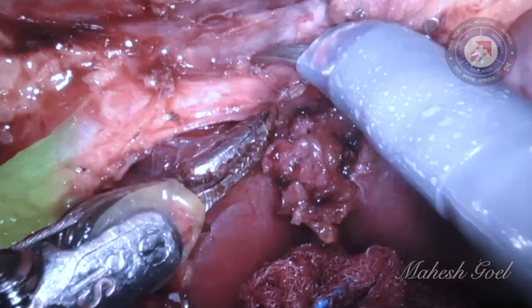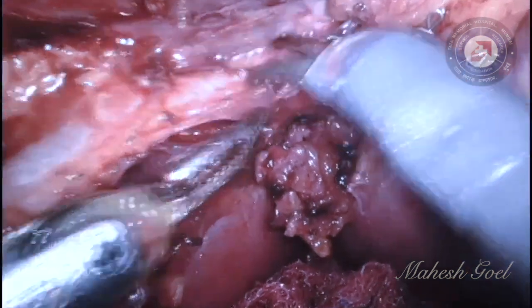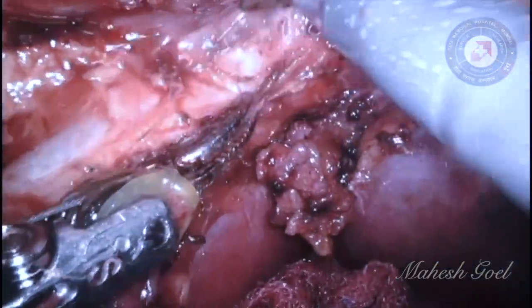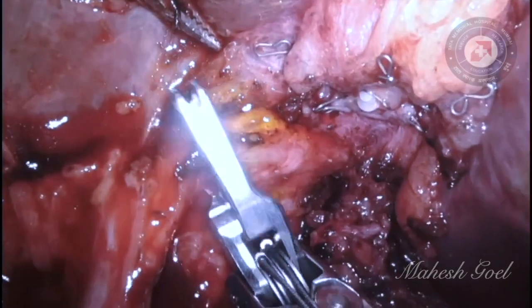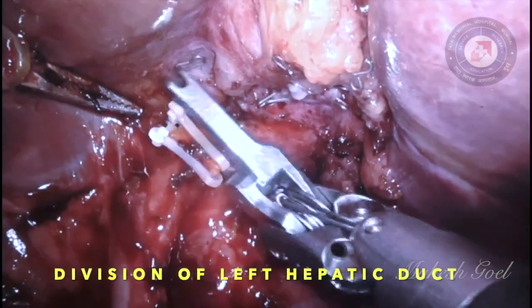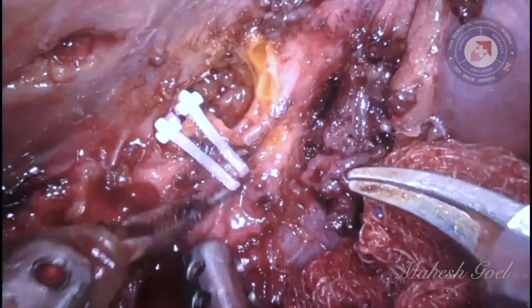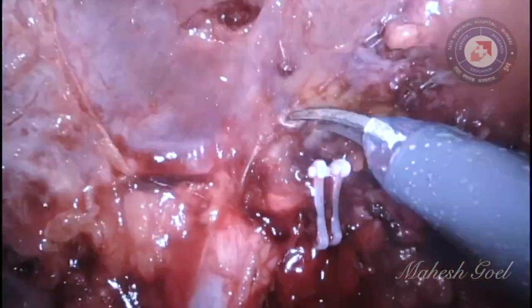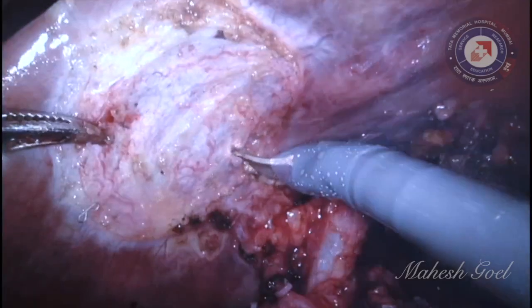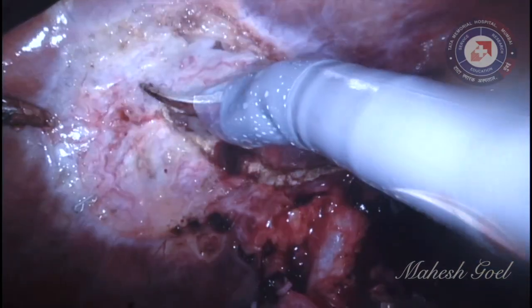With the artery and portal vein divided, we now turn our attention to the left hepatic duct. Generally we prefer to take the left hepatic duct intraparenchymally; however, since the left hepatic duct had a long extrahepatic course and was well visualized, it was dissected and transected before parenchymal transection. The transection plane is also marked on the undersurface of the liver, joining the plane that has already been marked previously.